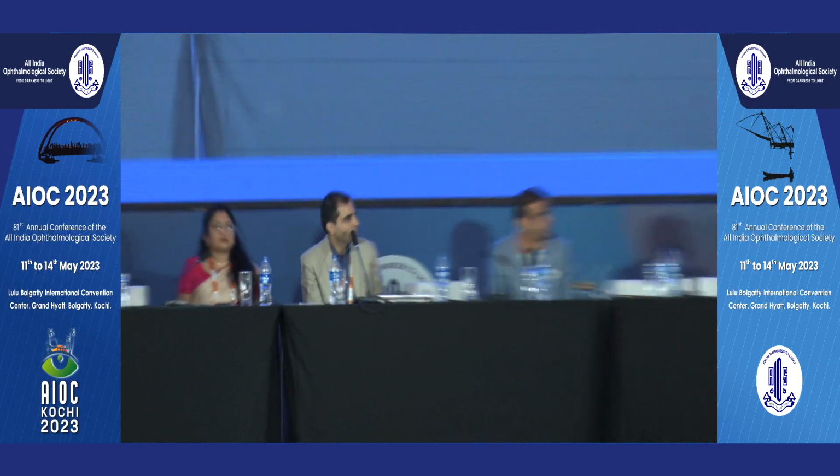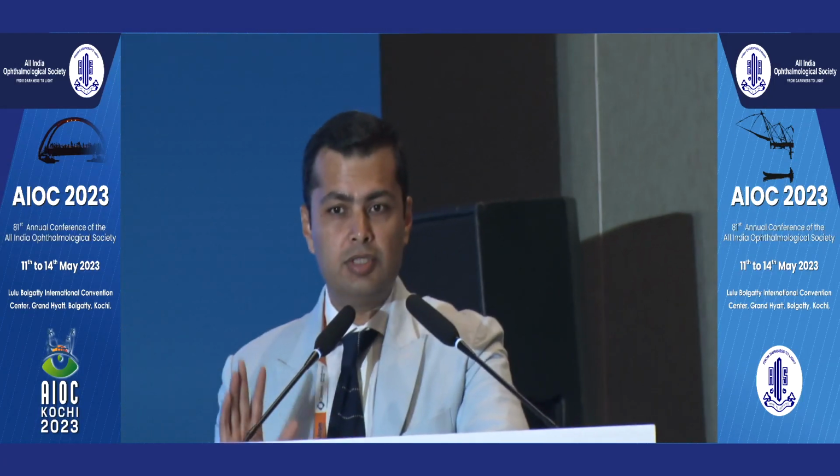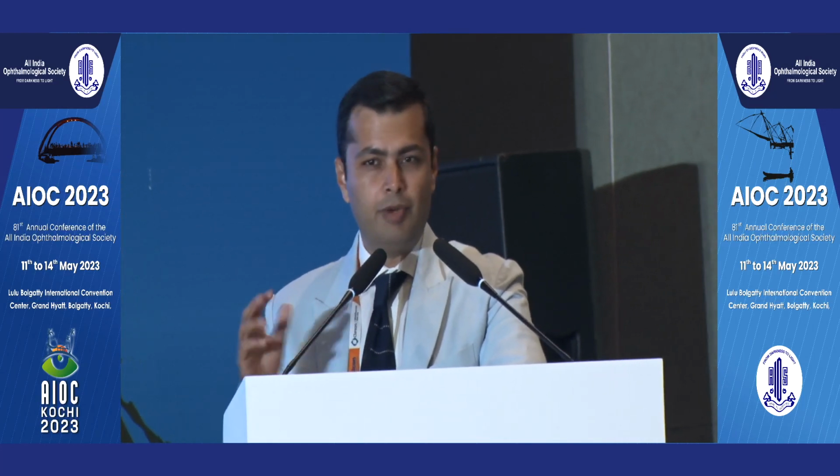I think at the least, if I were to set up a new clinic, I'd put an optical biometer and I'll put up an OCT. At least because I know my calculation is right. I can do a dry eye workup on a slit lamp and non-invasive breakup time and all that, but I can't replace a good biometry, and I can't replace that OCT, because I think OCT is right now extremely important, because there are so many outliers and patients are quick to judge.